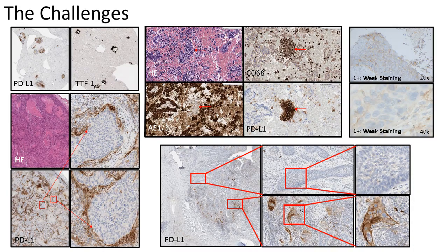Again, beneath that on the bottom left, you'll see a feature that we've termed the hugging effect, and this is where the PD-L1 positive signal in the stroma is actually hugging a tumour epithelial nest, perhaps best seen in this negative case here. So you really have to be unequivocally sure that the cell is either positive or negative, the tumour cell, before you actually include it in the score. And this can be very, very difficult when you've got sporadic single cell staining within the tumour.